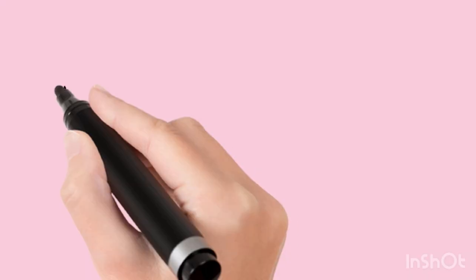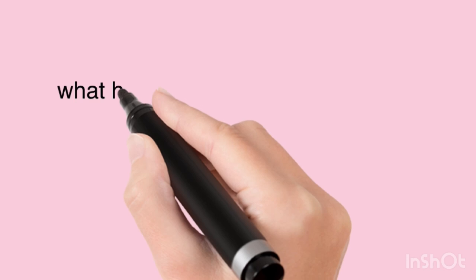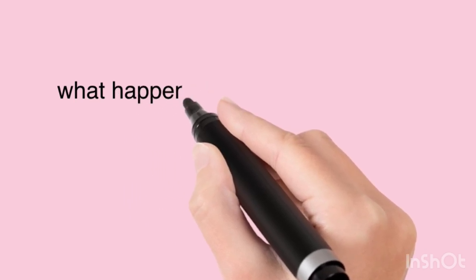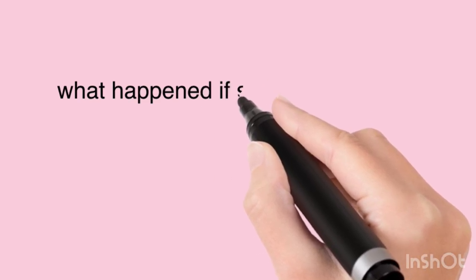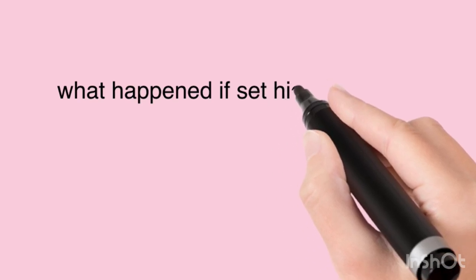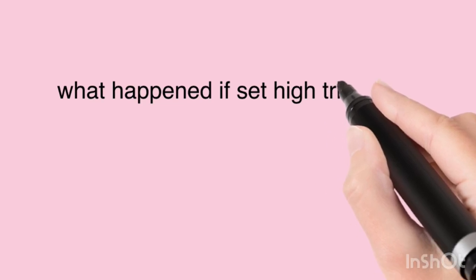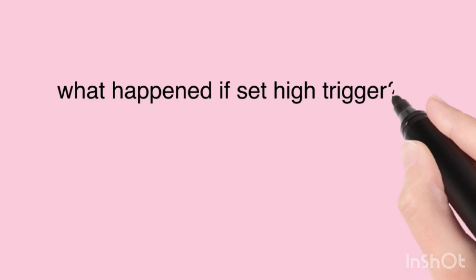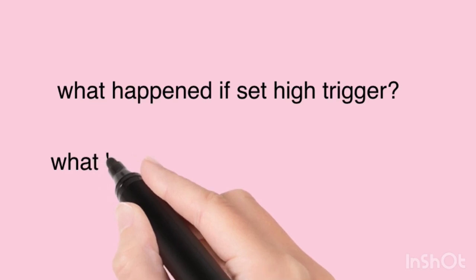Okay, now just think. I told you that the trigger should be around 2 to 5. If someone accidentally puts in a very high trigger, think 10 to 12, what will happen? The patient has to inhale very hard and generate a very high negative pressure in the tubing system for the ventilator to deliver the breath. That is practically impossible for someone to do, especially an ill patient. So the breaths will not be provided adequately.